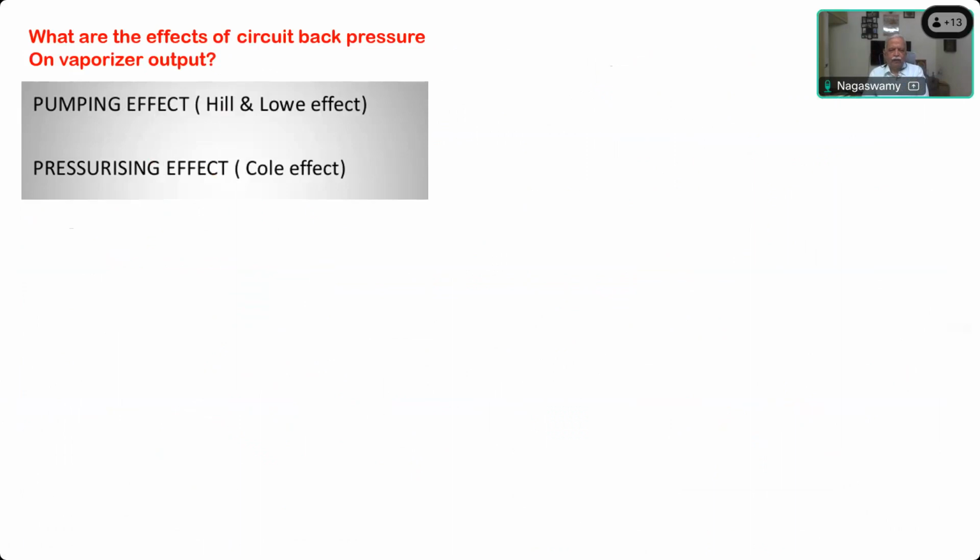So what will happen to the gases? Will they be pushed back into the vaporizing chamber to some extent? Yes, sir. There will be backflow, back pressure, pushing that into the vaporizing chamber. So will it pick up more vapor? Yes, sir. Why are you all hesitating so much? It will have to pick up more vapor.